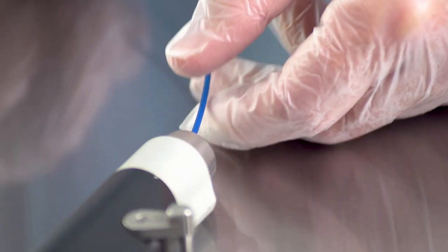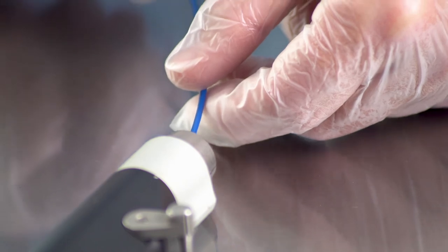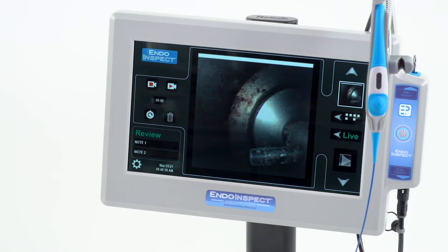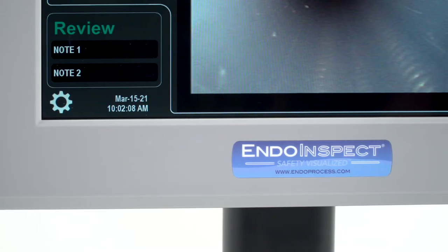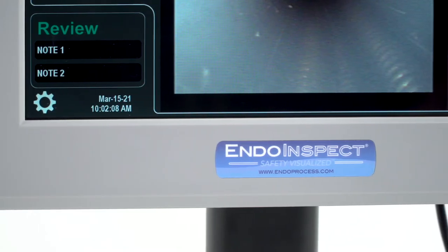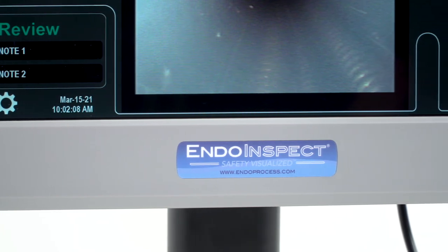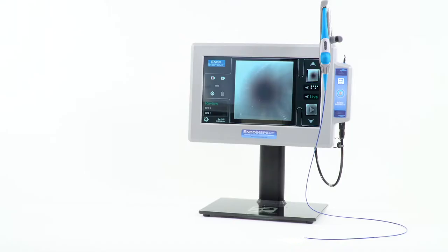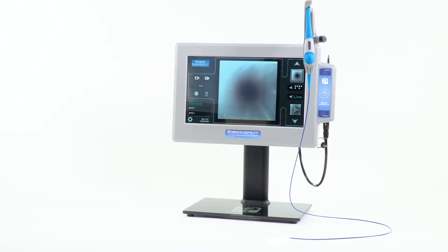The EndoInspect was designed to help sterile processing departments meet the challenges of cleaning tiny lumens and channels. The EndoInspect is for use in wet or dry areas. EndoInspect video Borescopes and Fiberscopes are IP68 rated and are suitable for continuous immersion in water. The EndoInspect is also easy to clean with high-level disinfectant.